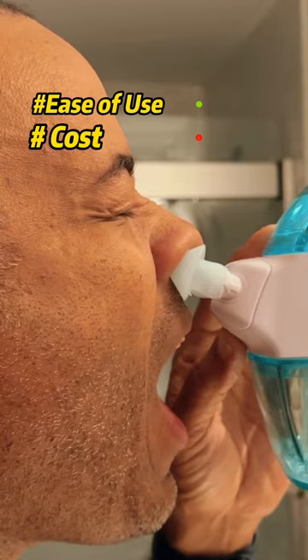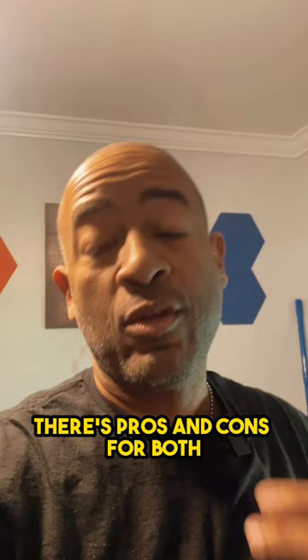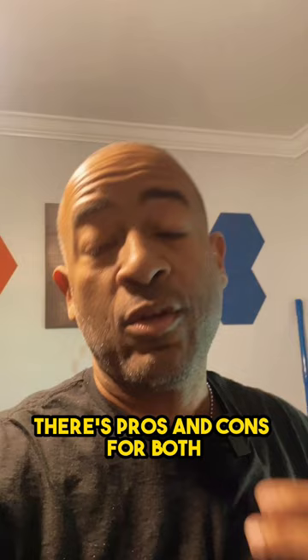Now let's compare that to the Navaj. There are pros and cons for both. Obviously the neti pot is a lower cost solution, whereas the Navaj is more expensive but may be a lot easier to use.